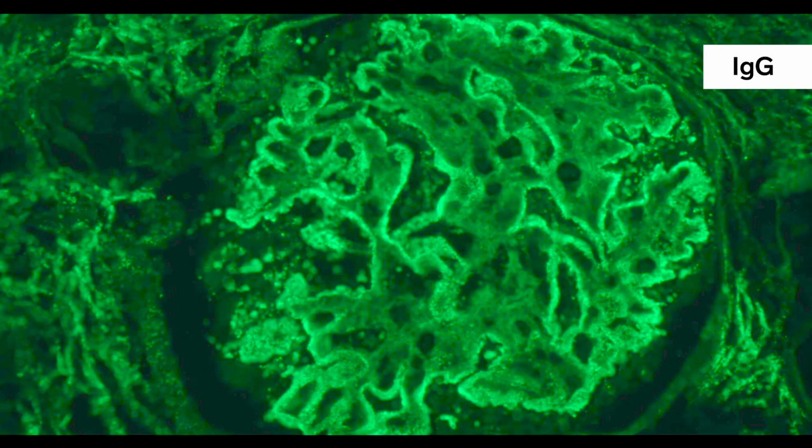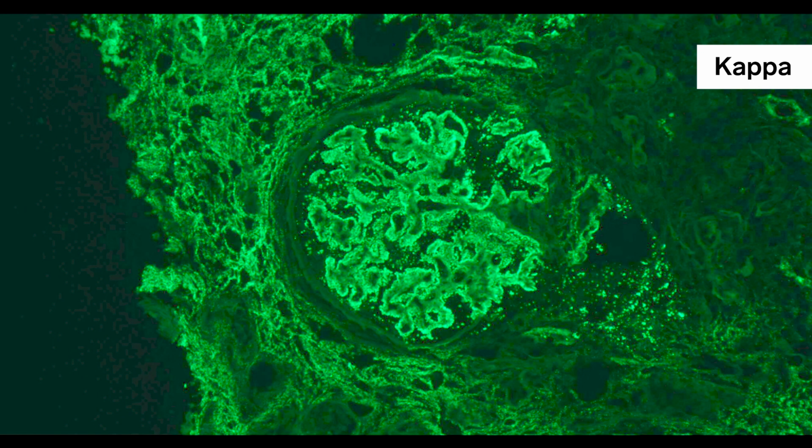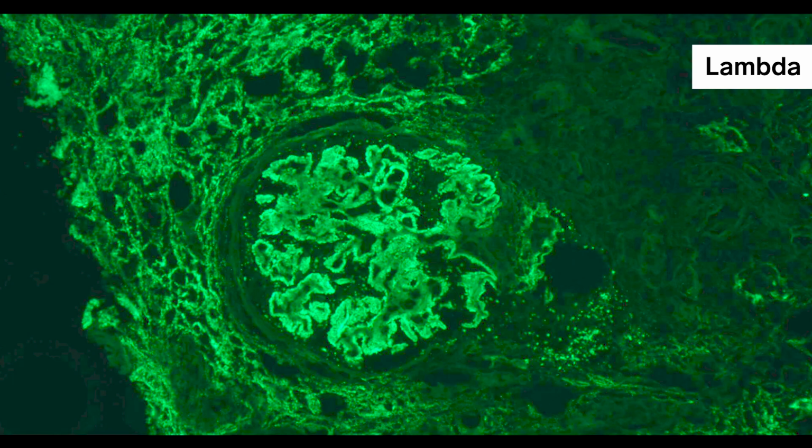So here we have our IgG immunofluorescence stain. We can see a 3+ granular staining along the capillary loops, so a very strong membranous pattern. And this pattern was similar for C3, and here we have also a picture of kappa and lambda. Another interesting finding is that we have some background staining within the tubular interstitium, also for IgG, kappa, and lambda. Given those findings, did you order any stains to further work up this case?